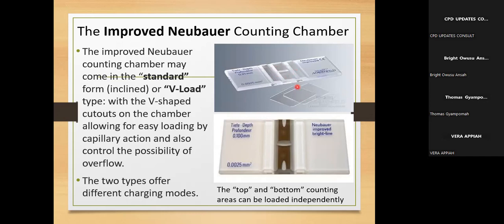Now let me come back to the cover slip. This cover slip is supposed to be laid on top here, and you see that the block here and the block here are higher than the platform here. So this one and this one are on the same level, okay? But this one here is lower than this side. So if I put the cover slip on it, it is going to leave me a space down here. And that is the space which we call the depth of the chamber. And this is the value, 0.1. So 0.1000, this is the depth of the chamber. It means that if I put a cover slip on these blocks, and because these levels are higher than this level, it will leave me a space below. And that space below is what we call the depth of the chamber. And it's supposed to be 0.1 millimeters. I hope that one is clear. Good. Right.